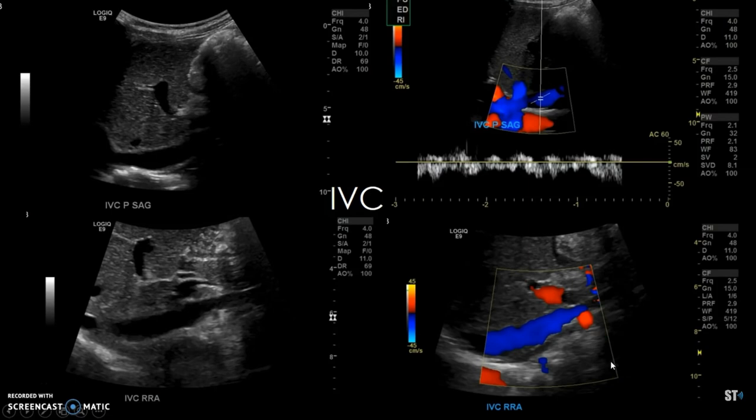After you finish your aorta, you go to the IVC proximal. You see right here it's going into the right atrium. Here you can see the right renal artery behind the IVC. And there's going to be a phasicity in the waveform of the IVC as the patient breathes.